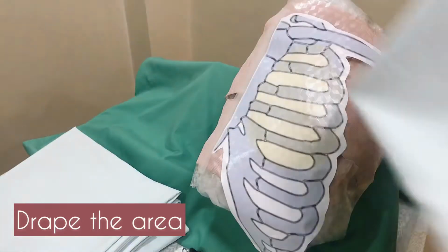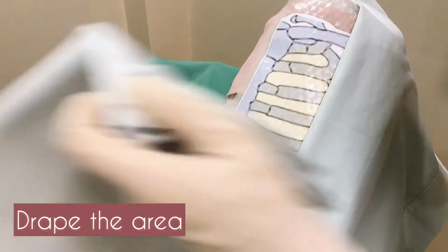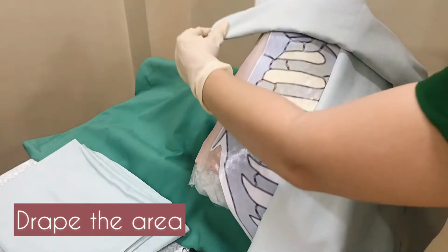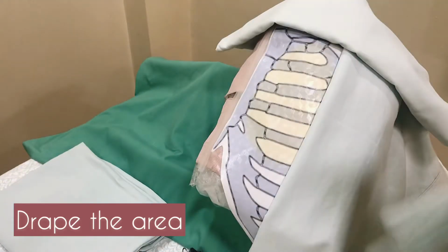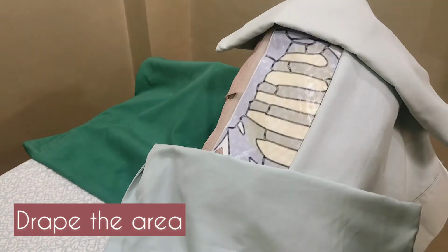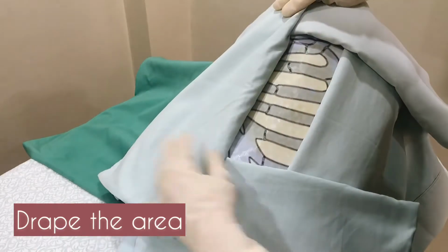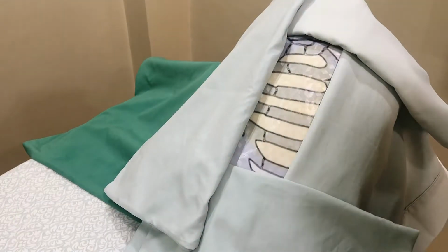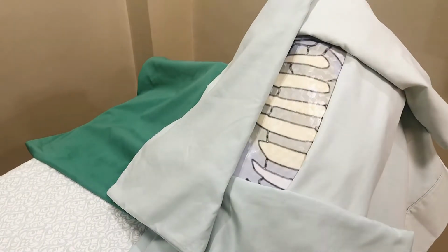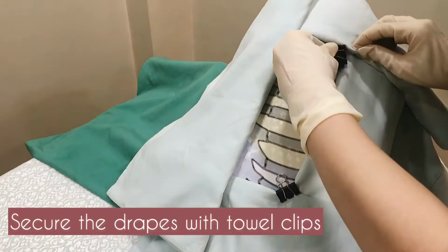Drape the area with 4 towels and not with a single fenestrated sheet. Start with the area nearest the surgeon. Then proceed cephalad, caudad, and lastly at the side away from the surgeon. Secure the drapes using the towel clips.